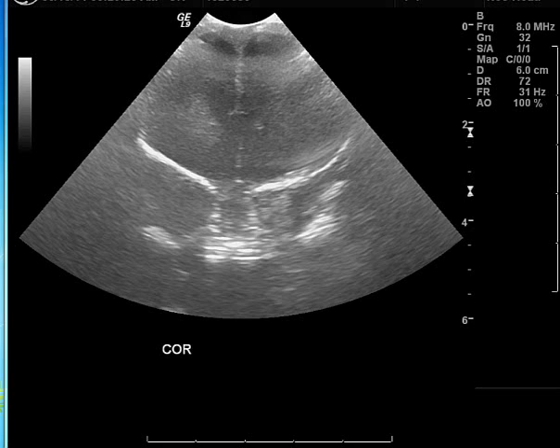The scan is most often done by the technologist. However, the resident is encouraged to be present for at least a couple of these scans so that the resident gets an idea of what to expect to see, and also gets an idea of how to perform the ultrasound — particularly in the ER setting where you might get called in to take a look at or even perform the ultrasound.